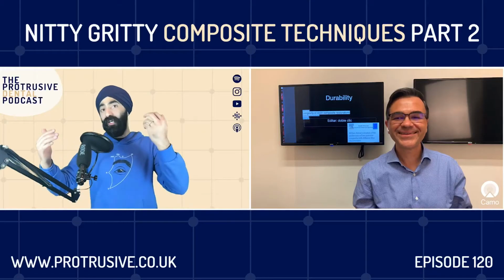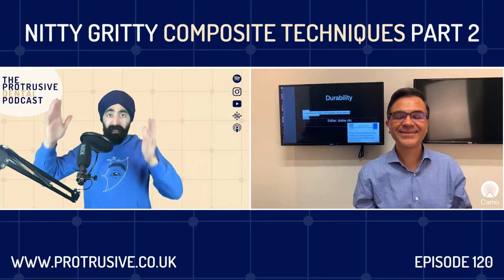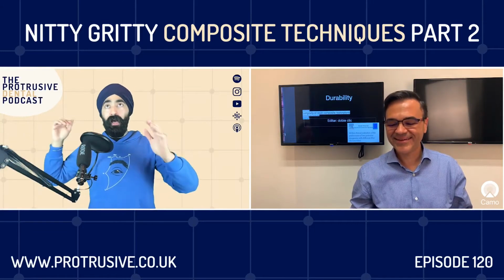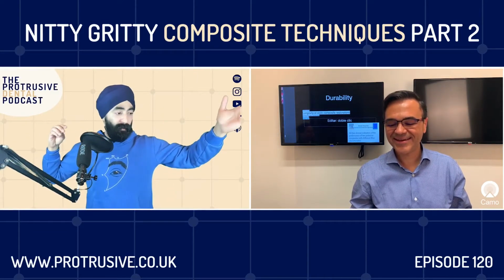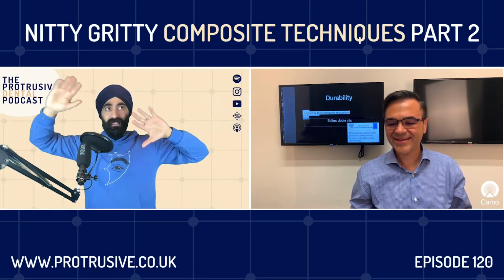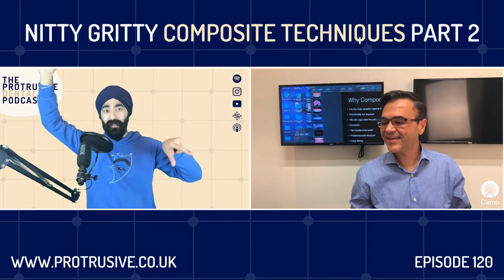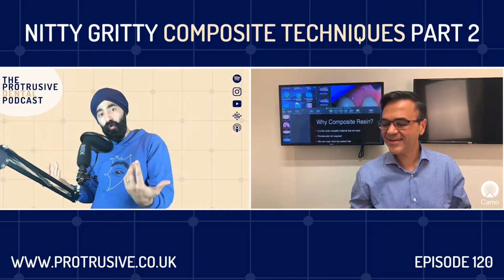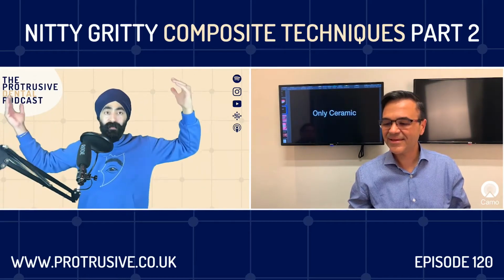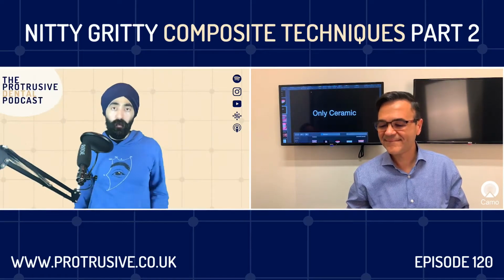Something that we've discussed on our Protrusive Dental Community Facebook group many times is interproximal management. I'm a Mylar pull kind of guy, and I know I went to see Pascal Magnier in Edinburgh recently. He is a big fan of PTFE and just taking the composite right up to the PTFE, and he's some sort of wizard like that. What is your recommendation? What is your protocol for interproximal management to prevent the composites being stuck together and getting the nice, smooth, flossable interproximal surfaces?